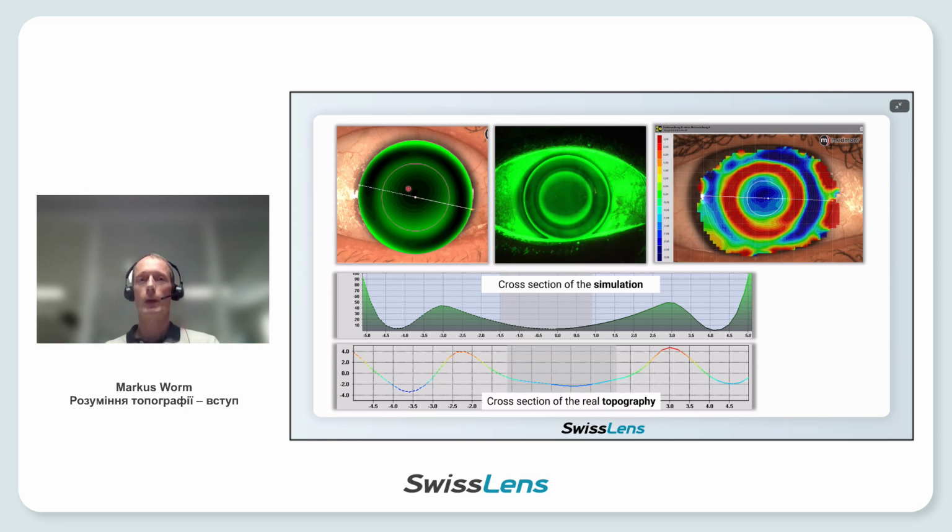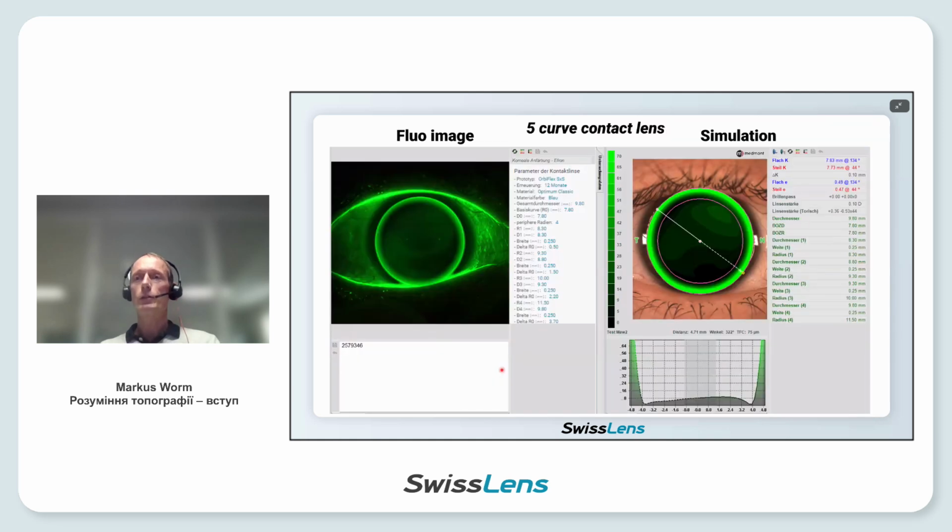You can compare the simulation, the real fluo image, and the bullseye of the topography, and especially here in the cross section, the simulation and the real topography show more or less the same result. The same for a multi-curve lens, slightly touching here and here in the periphery, and the same in the simulation on the right side. And more fluo here in the center. It's well comparable for both images.